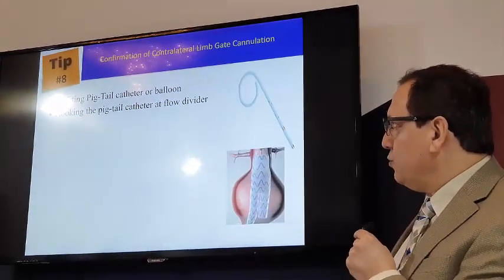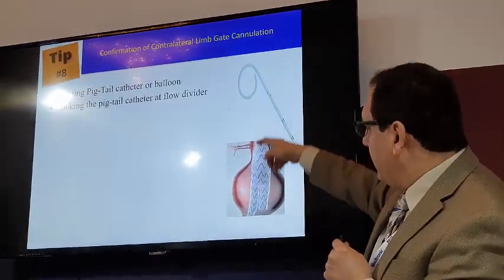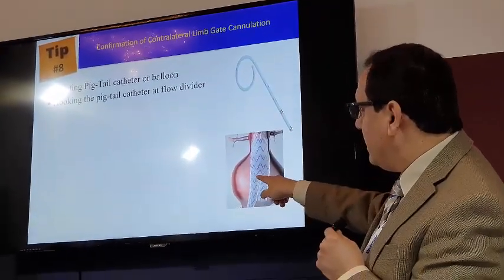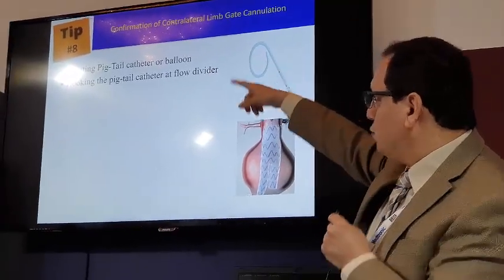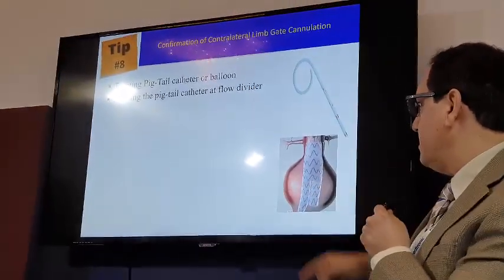The second option is hooking the tip. So you have a pigtail and you pull it down until you hit the flow divider. And when you pull it down, you can see the pigtail is going to open up. And this means you are inside, it's not behind.